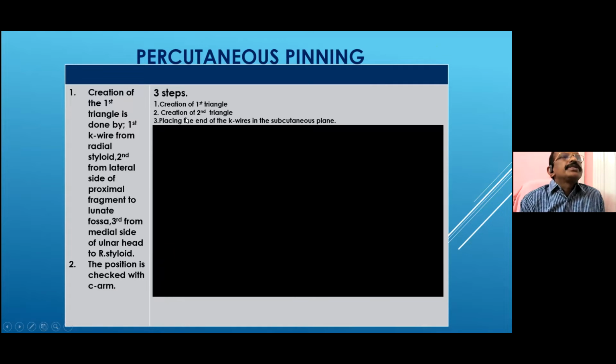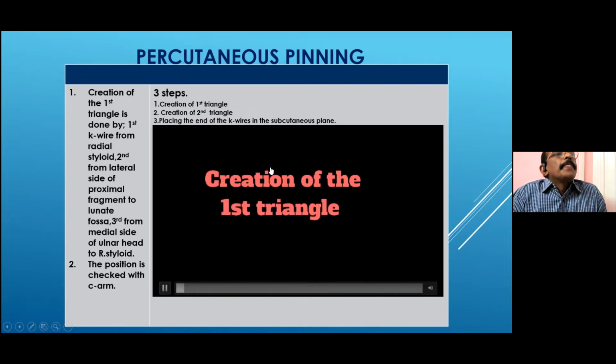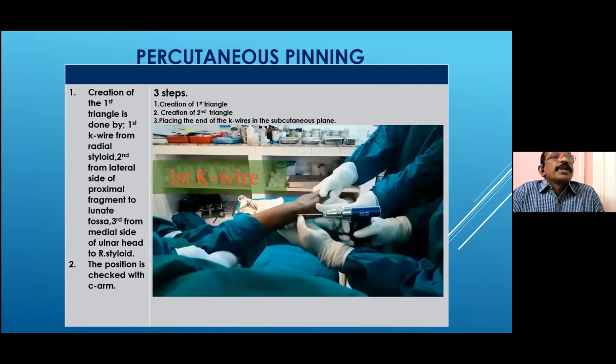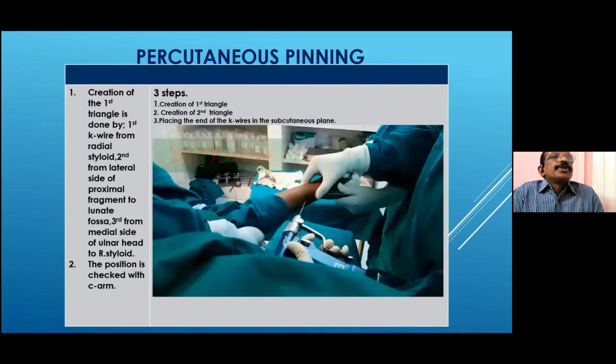The pinning has three steps: the creation of the first triangle, the creation of the second triangle, and the placing of the ends of the wires in the subcutaneous plane. You can see, the first triangle is created by the first wire from the radial styloid towards the proximal fragment at an angle of 40 to 60 degrees.